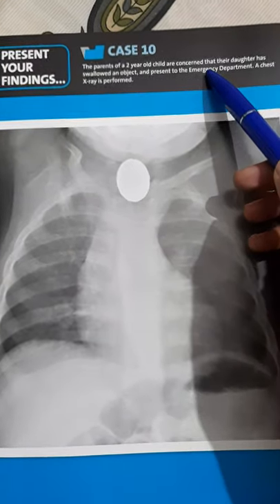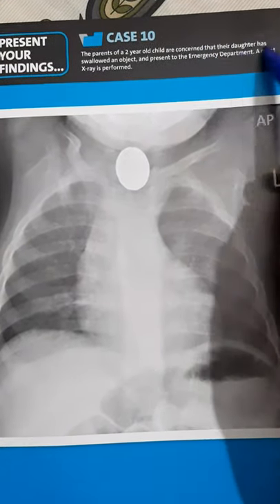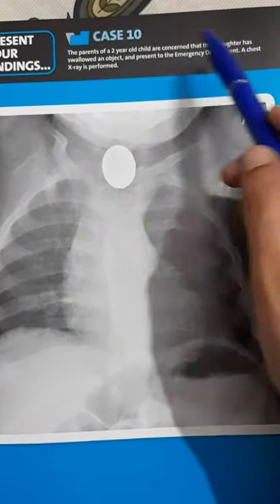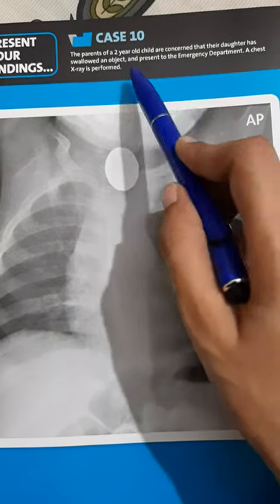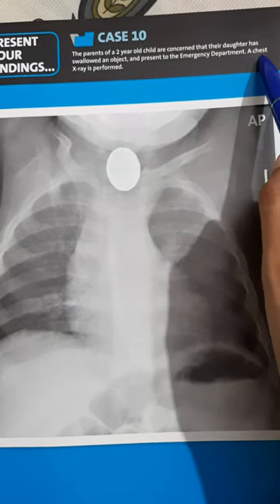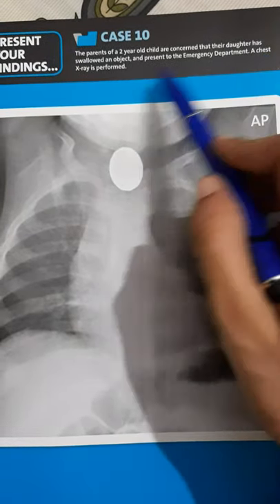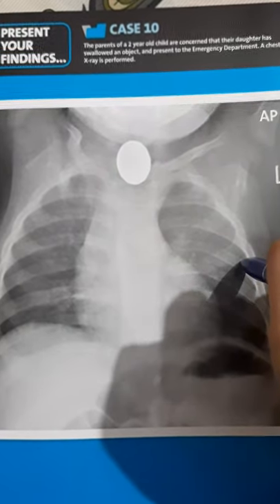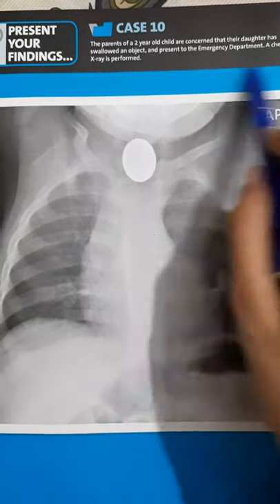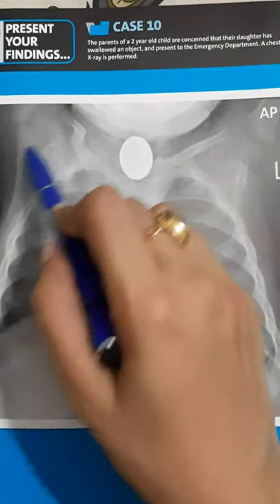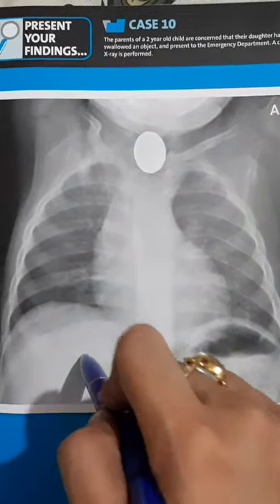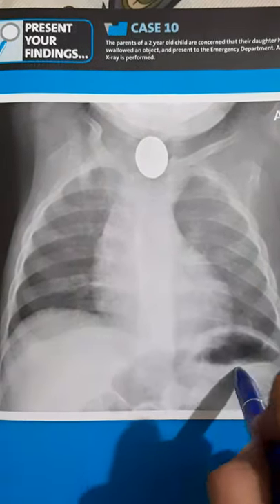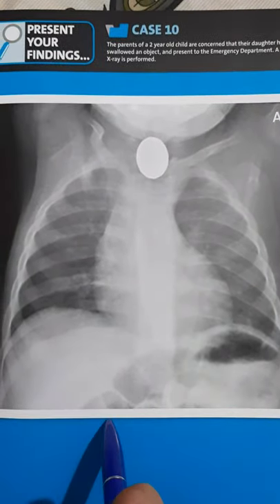The parents of a two-year-old child are concerned that their daughter has swallowed an object. They present to the emergency department, and a chest x-ray is performed as part of the investigation. This is the PA view chest x-ray of that child.